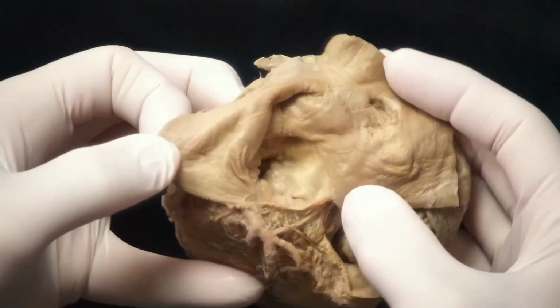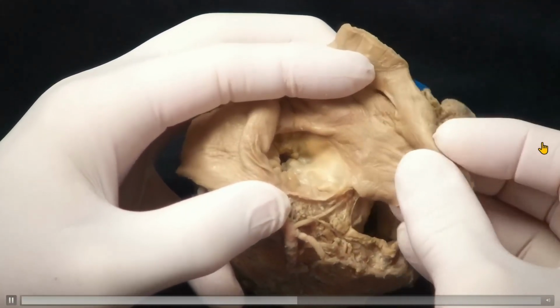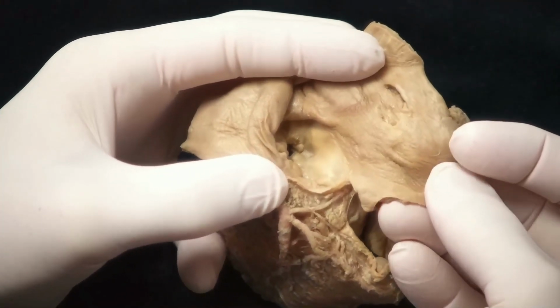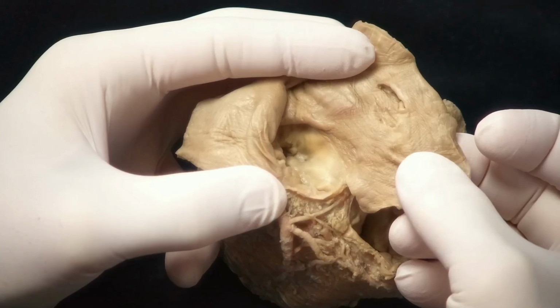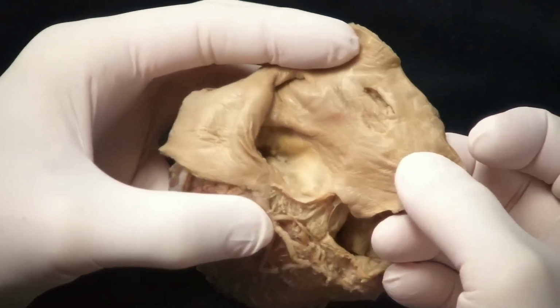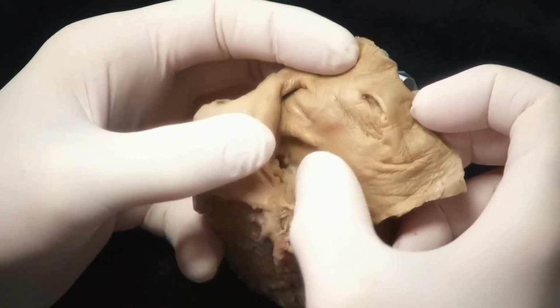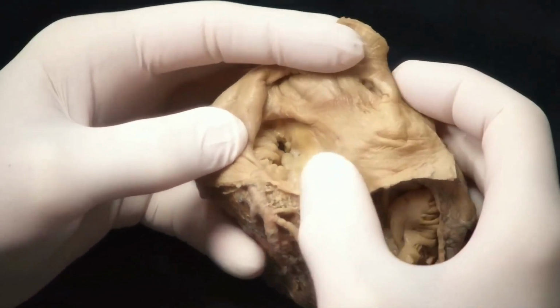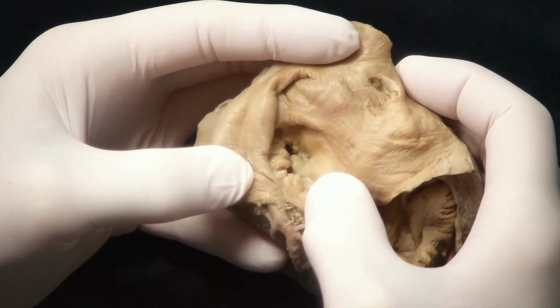So here's a second case, where we're looking from the left atrial aspect, the left side, and you can just about make out the region of the oval fossa here. So a posterior puncture would be where my thumb is just here. And certainly it should be possible to steer the sheath into the mitral valve, as we've been showing you so far, to reach the leaflets and perform an edge-to-edge repair.